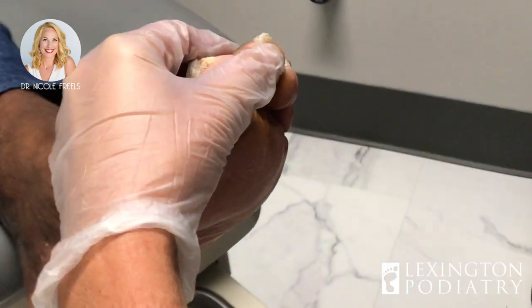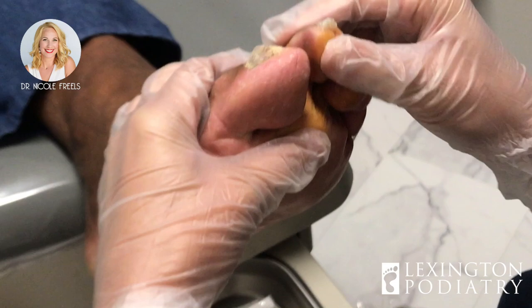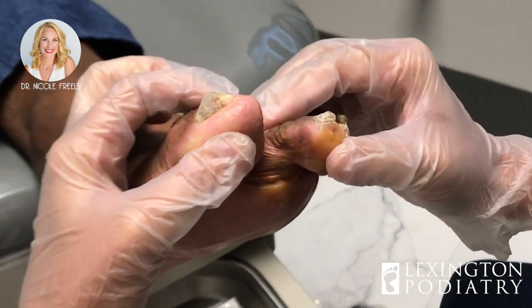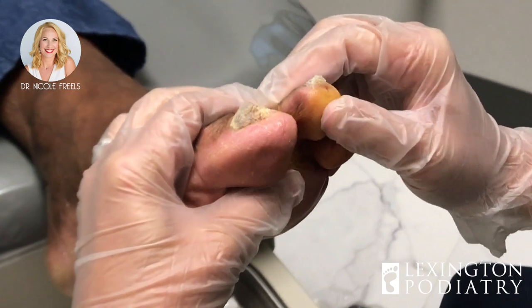Good deal. Look at this — not even a drop of blood. So we went from that toe that was rigid, setting him up for an ulcer, to now whenever he stands up it's going to help straighten out.